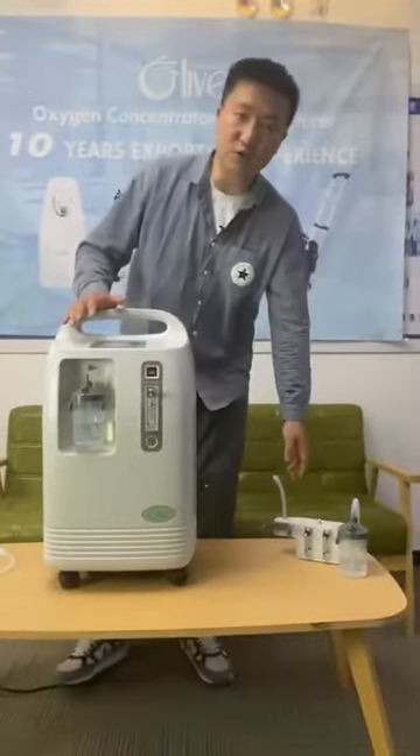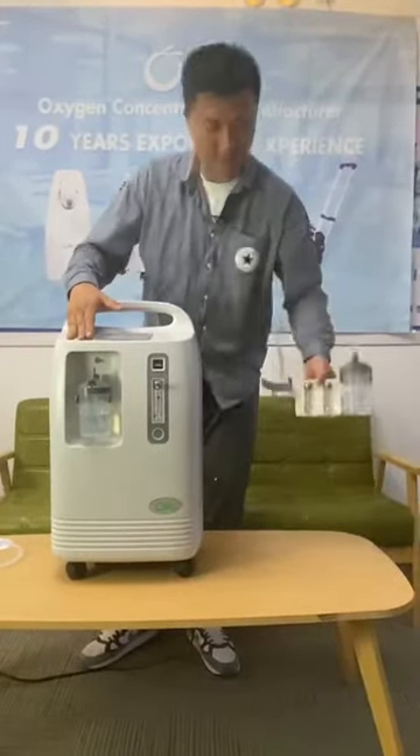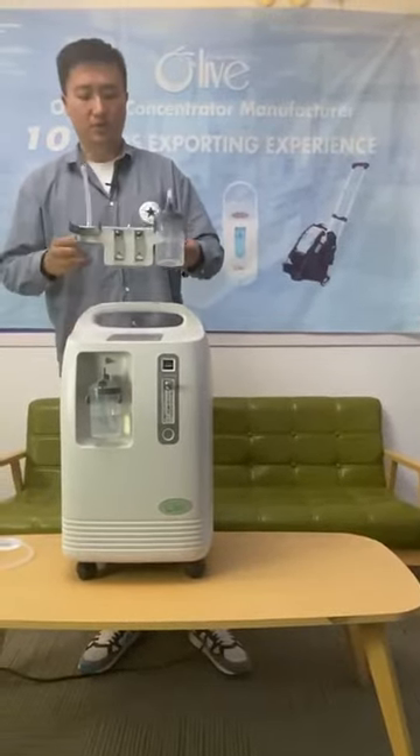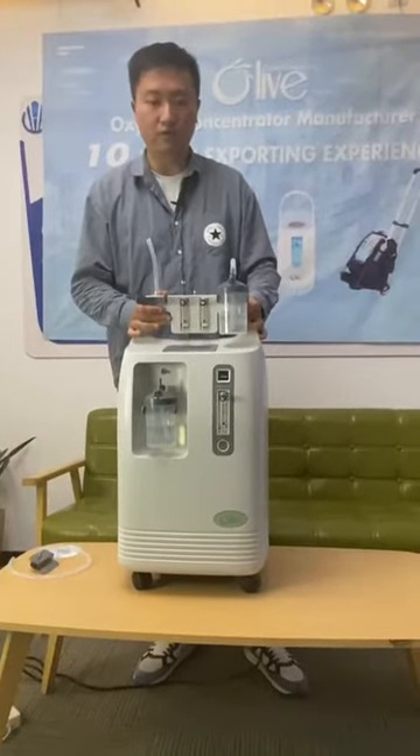Recently, we came out with a new device which allows our OLV-10S to turn into a dual flow option.